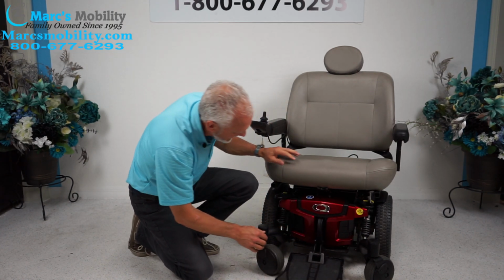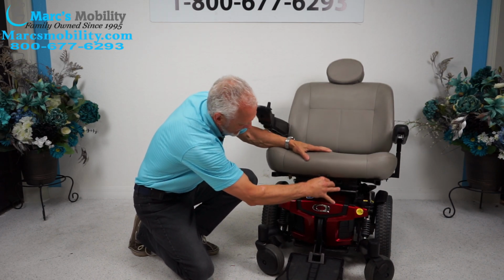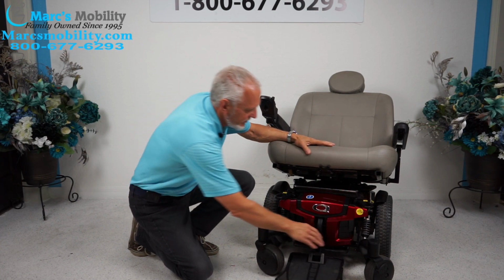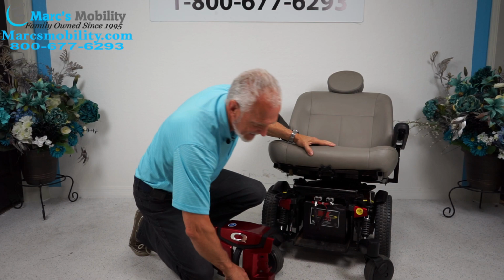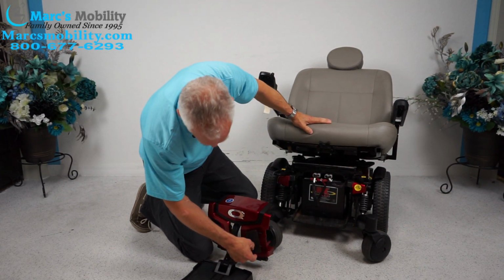Now this one here, because the seat is so low to the chair, I'm going to tip the seat back a little bit. So by squeezing these, I could actually take the seat off. But now I'm going to pull this up, and you can see this is only a cosmetic cover.